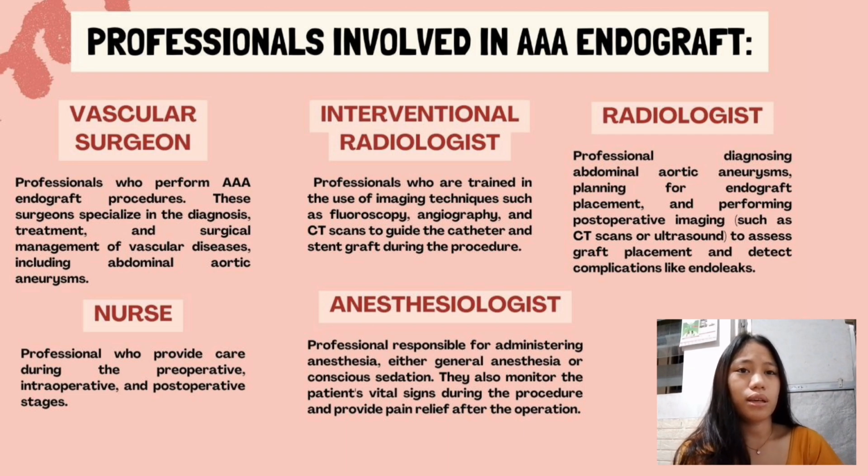Endovascular specialists, interventional radiologists, often working closely with the vascular surgeon, perform minimally invasive procedures like AAA endograft placement. They are trained in the use of imaging techniques such as fluoroscopy, angiography, and CT scan to guide the catheter and stent graft during the procedure.